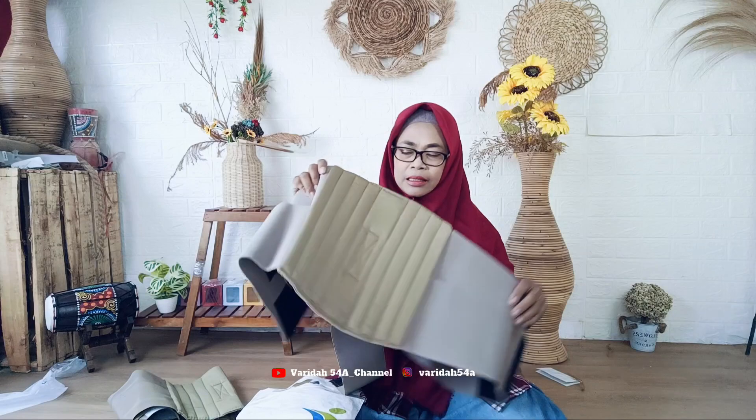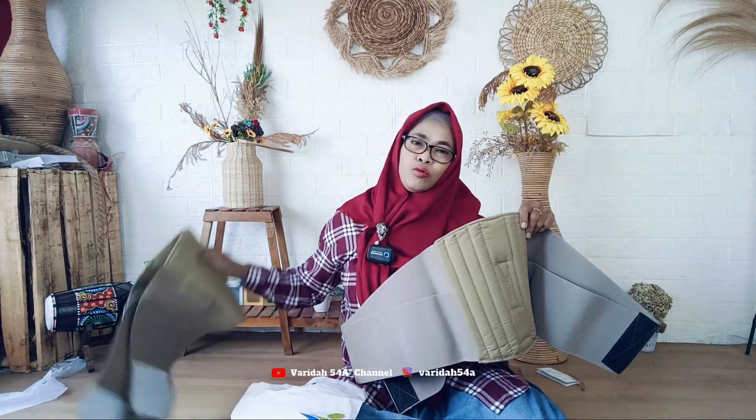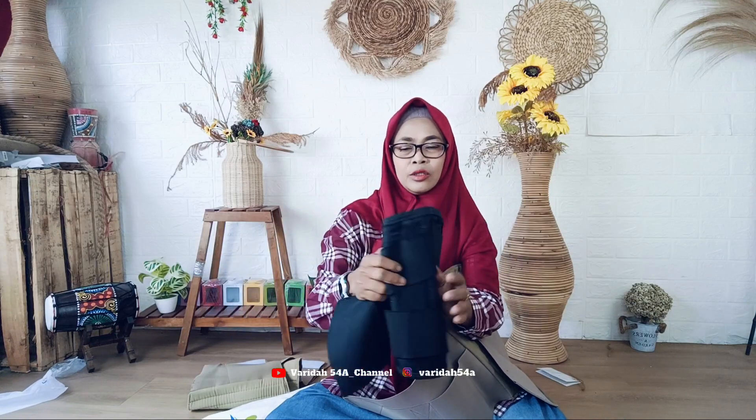Ini saya beli Stella, memang warnanya satu warna ya teman-teman, warnanya coklat, bagus dan netral. Sebelumnya saya sudah pernah beli ukuran L tapi kekecilan. Sekarang ini saya beli ukuran XL. Yang dulu ukuran L sama saja kurang cukup, jadi sekarang saya beli XL.